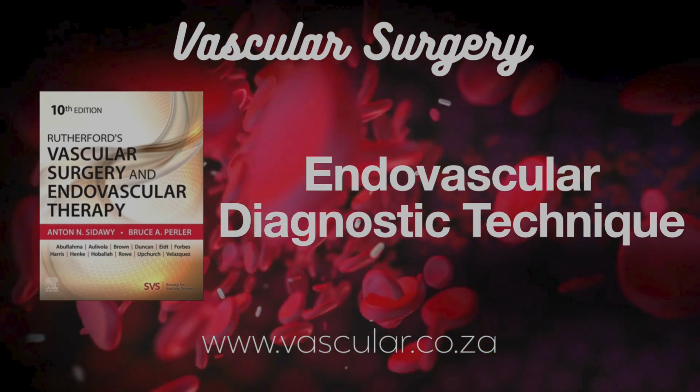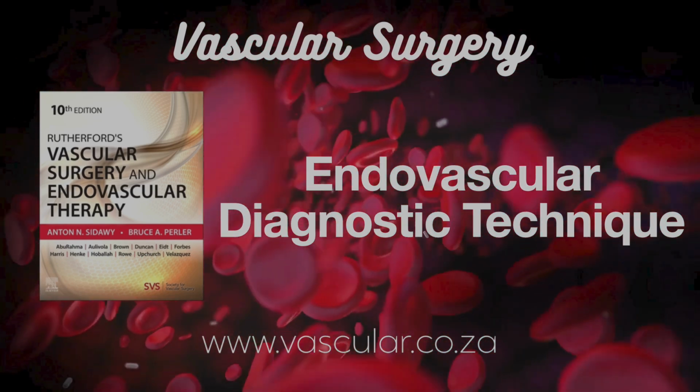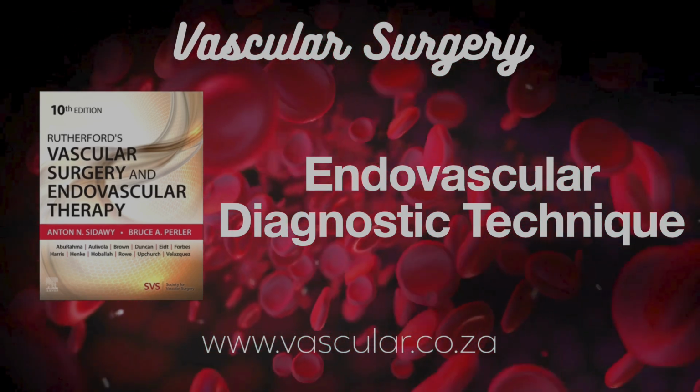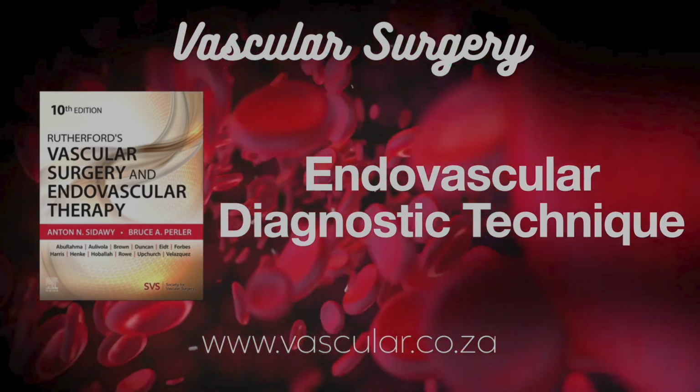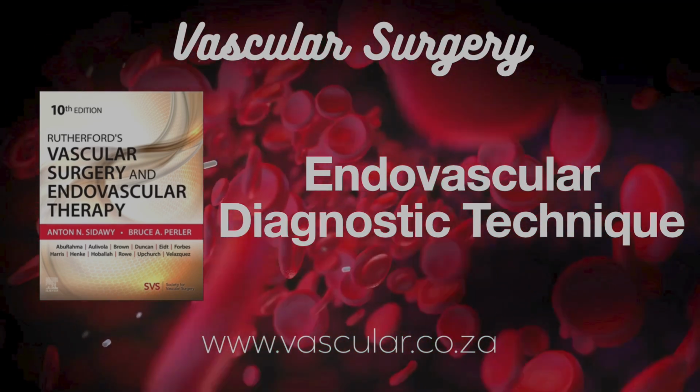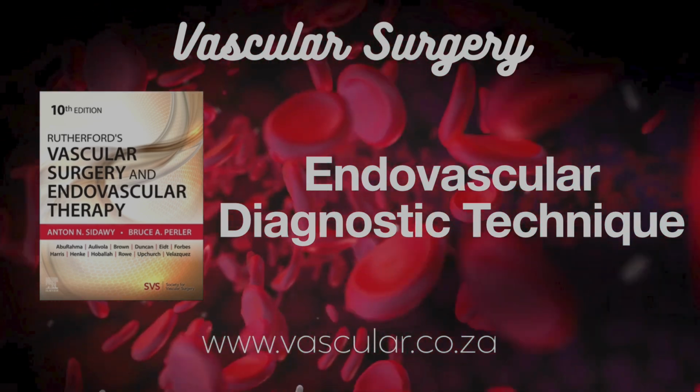And last one for arteries. The common carotid in the neck. Sounds risky. It is. Percutaneous access there just for diagnosis is rare. Too much risk of stroke from clots or just blood flow. And hemostasis is very tricky, dangerous to compress there.